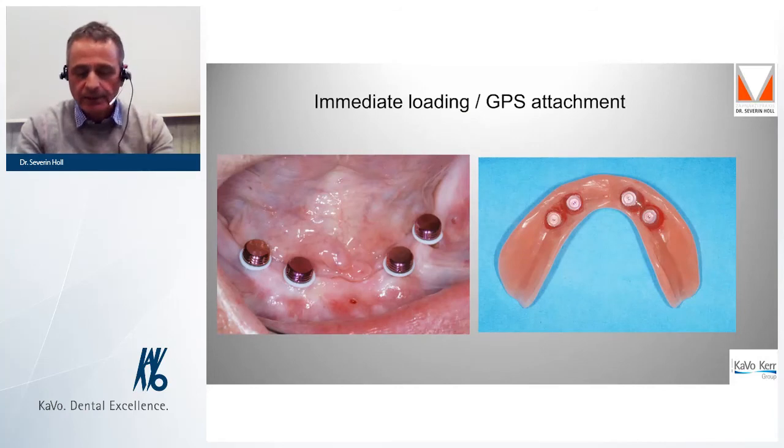Again, a similar case in the lower jaw. Immediate fixation of GPS attachments. You see the small wounds of the anchor pins. On the right image, the polymerized GPS attachments in the prosthesis.